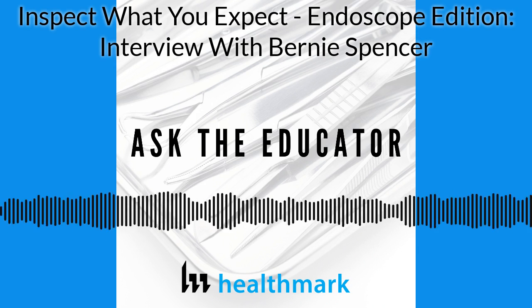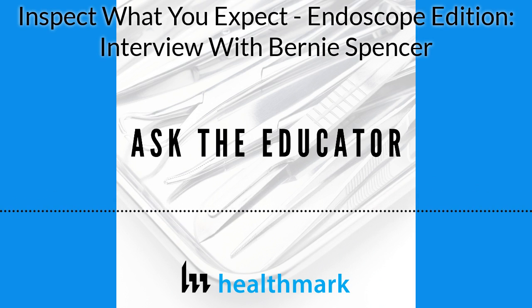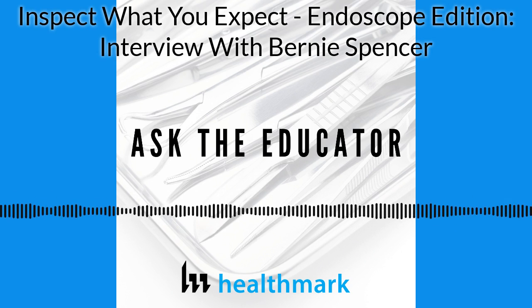The second test that we purchased, what you do is you fit a small plastic Ziploc baggie over the distal end of the insertion tube, and then you inject 20 mLs of sterile water into the biopsy port. And that water is captured in that Ziploc bag. Take the bag off the end of the insertion tube, and then dip a strip into the bag.